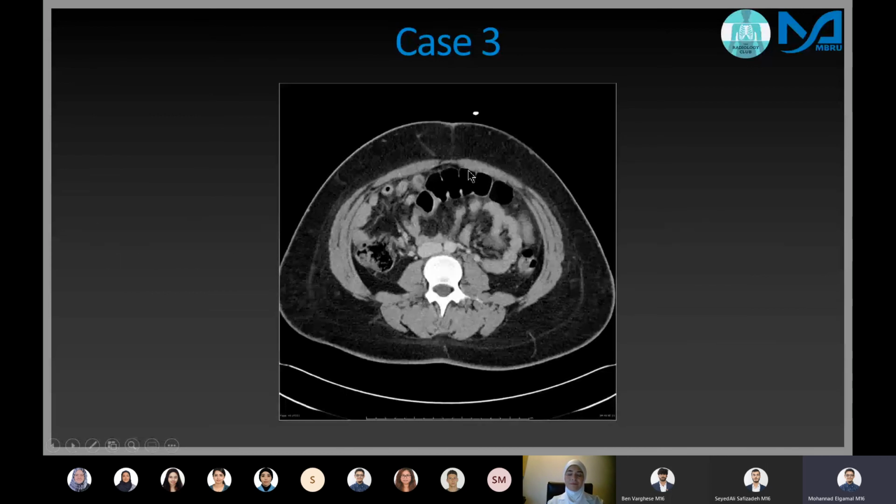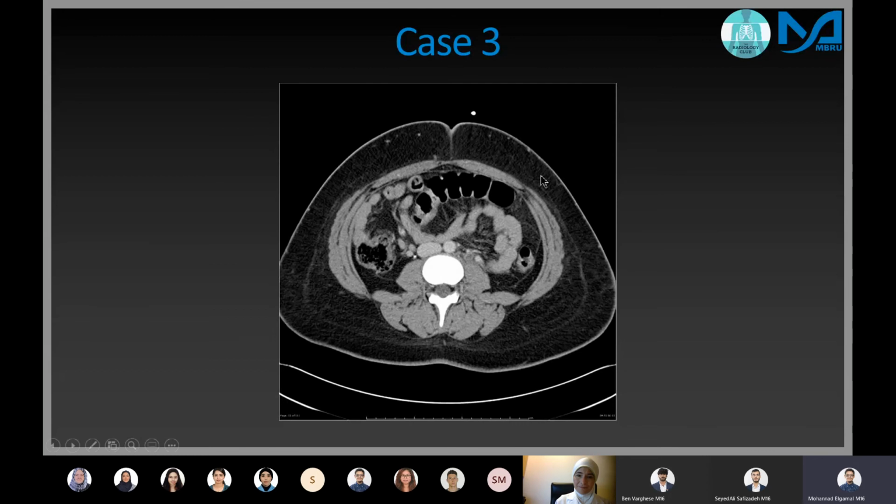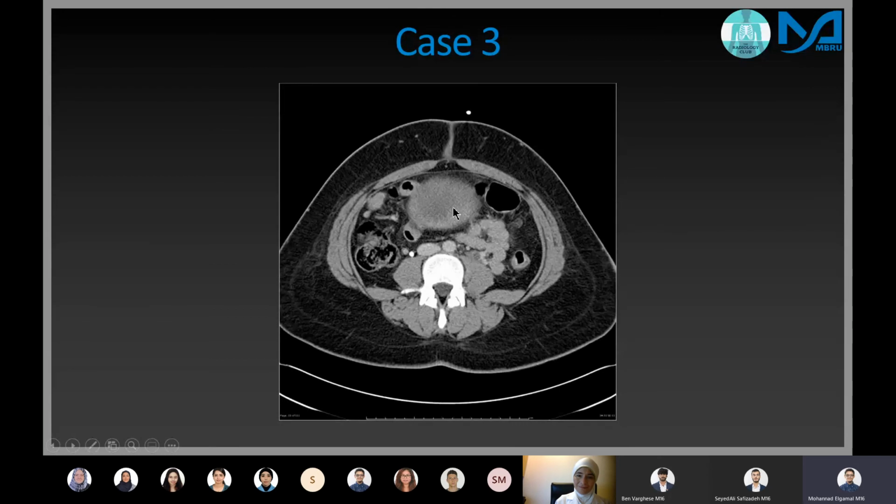But before we do, I wanted to show you there's some subcutaneous... I think it was described as... give me a second. Yeah, it was described as a minor anterior inferior abdominal wall subcutaneous fat stranding, and this would usually happen because of a seatbelt injury. So radiologists know if you wore your seatbelt or not when you got into the car accident, because of signs like that. Anyways, let's go down to the uterus.